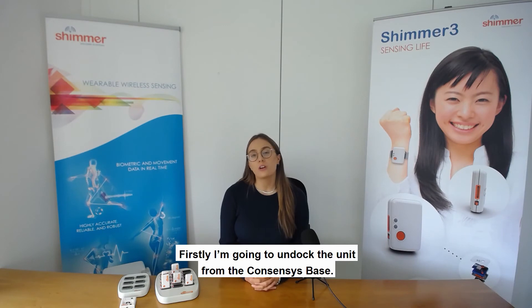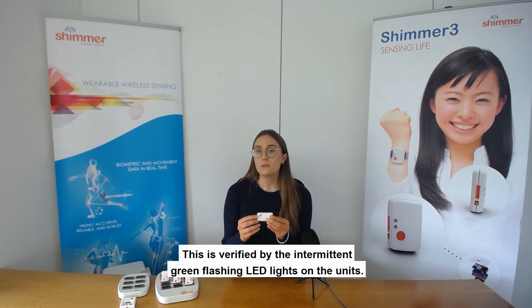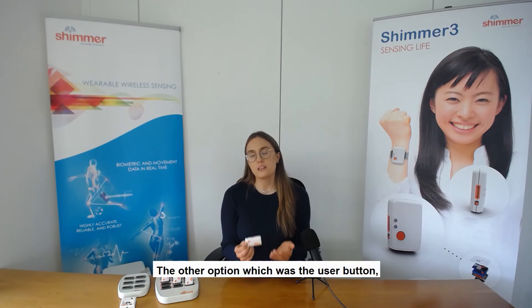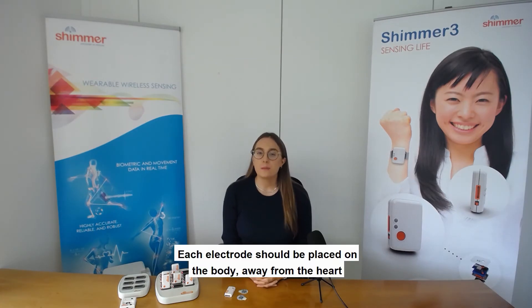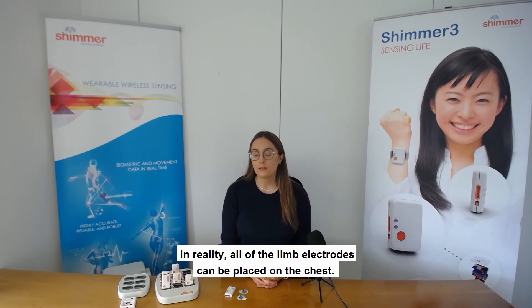My unit is now ready to start collecting data. I'm going to undock the unit from the Consensus base — it is now logging data to the inbuilt SD card. This is verified by the intermittent green flashing LED lights on the unit. The LEDs on Shimmer units indicate what state they are in. The other option is the User button — by pressing the orange button, it would either log to the SD card or not.